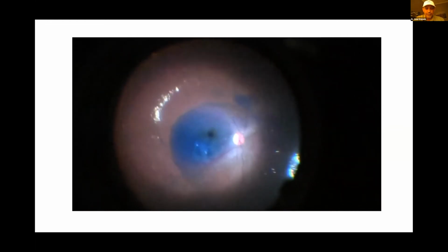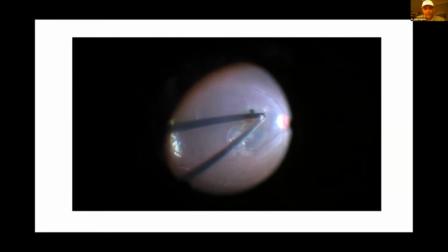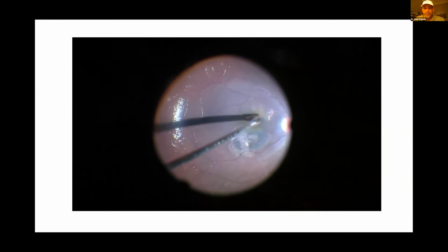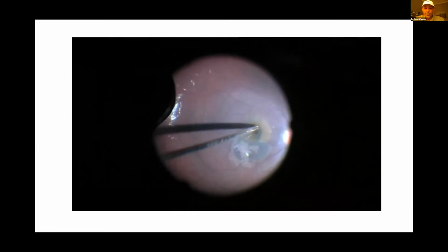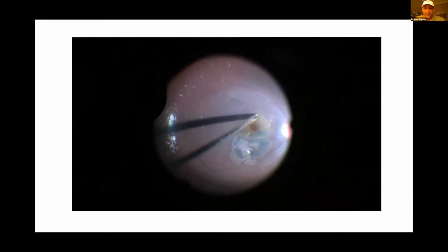And then I use membrane blue to try to stain the ILM. And in these cases, sometimes you might have to stain multiple times. But I was lucky in this patient, and we stained only once. After you leave it for a while, you start to catch an edge wherever you try. What I'm trying to do in this case is to do a fovea sparing ILM peel. I tend in these large macular holes not to peel all the ILM, because just in case it does not work and I come back, I can get a free flap and cover the hole. So I'm trying to be conservative with the ILM, but I'm trying to hold it.